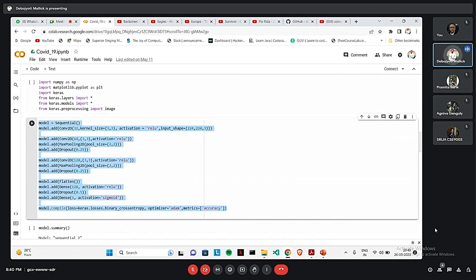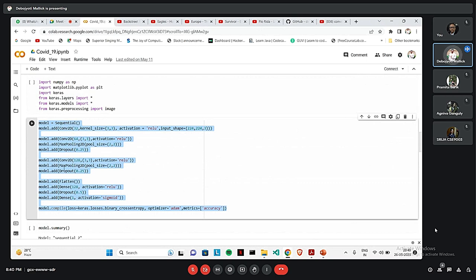The second layer is a convolutional layer 2D of 64, 3 by 3. Activation is ReLU. We have added max pooling of pool size 2 by 2 and then dropout of 0.25. Then again, we have added a convolutional network of 128, 3 by 3. Activation is again ReLU. Added max pooling 2D, pool size of 2 by 2 and dropout 0.25. Then we have flattened, we have used the flatten function and then we have added dense of 128 activation ReLU, dropout of 0.5. And lastly, dense of 1 activation is Sigmoid.